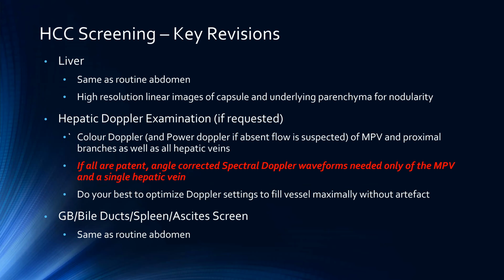Otherwise, we just require color Doppler of the main right and left portal veins, as well as the hepatic veins, to confirm patency and appropriate direction of flow. The full hepatic Doppler examination is only necessary if it's requested, at least for the time being. That again may change, but for the time being, that's what we're going to limit it to.